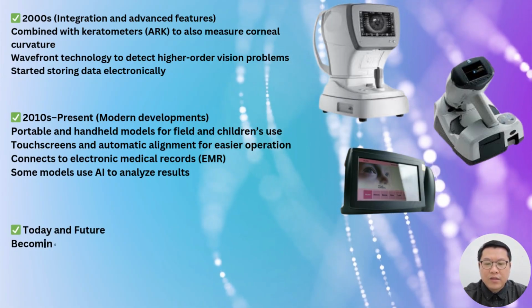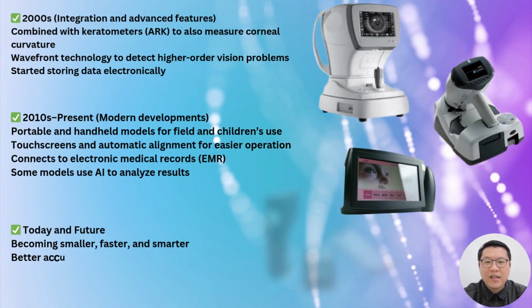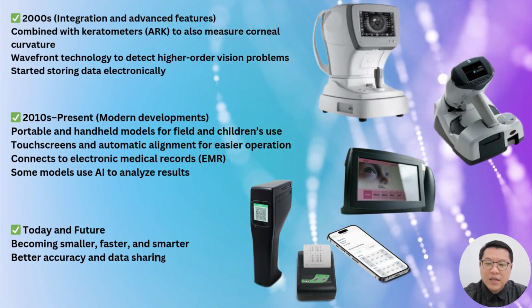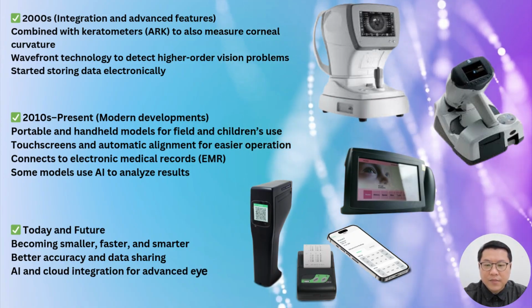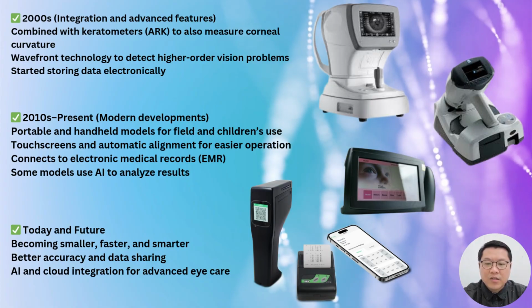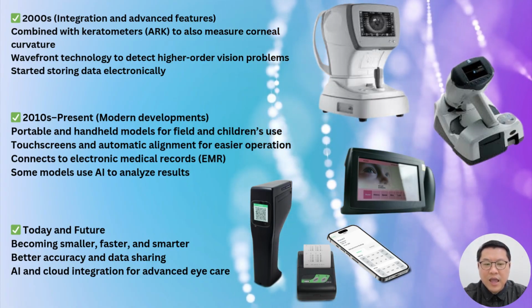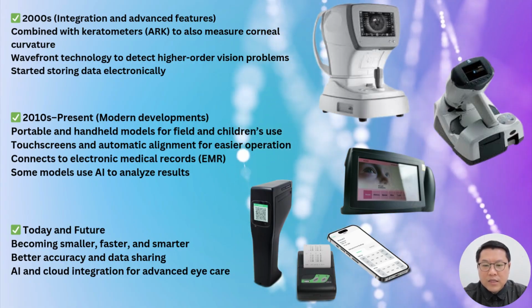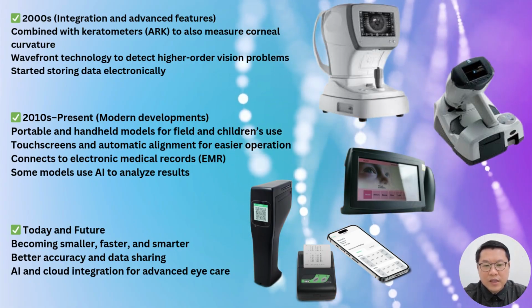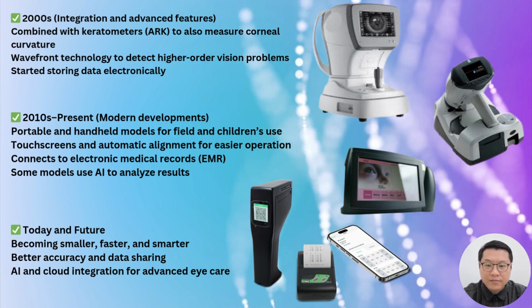Today, autorefractors continue to evolve. They become smaller, faster, and smarter. Accuracy keeps improving, and data can be shared instantly with other systems. AI and cloud integration are expected to further enhance diagnostic precision and accessibility. In the future, we may see fully automated vision screening tools powered by AI, accessible even in remote areas.